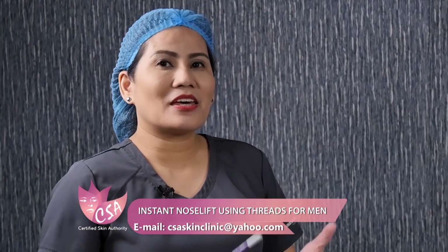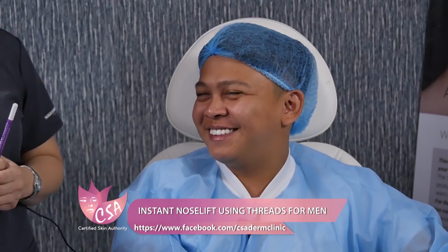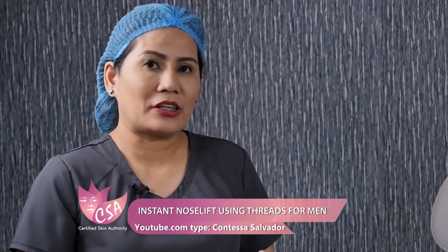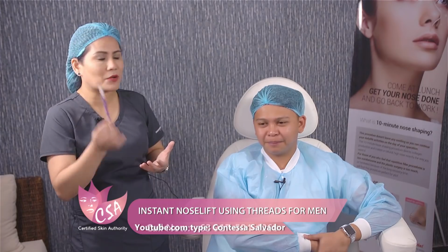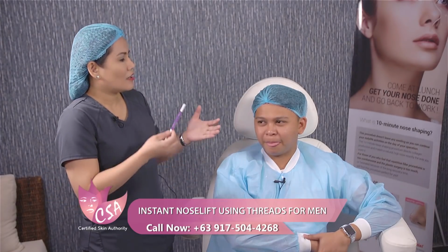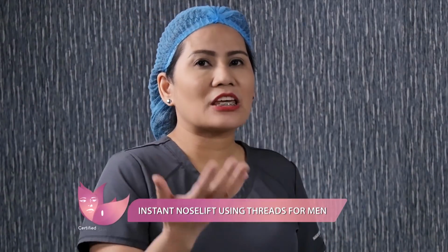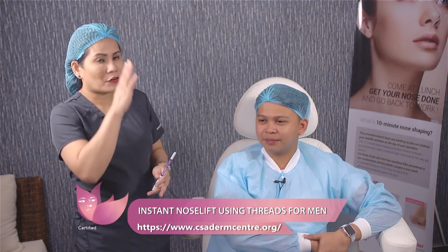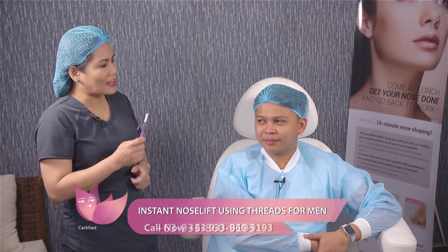So ngayon, ano ba yung magiging treatment natin kay Neil? Excited ka ba, Neil, to know? So much. Yeah. Before we were talking about the nose filler, we did nose filling for Neil. Right now, it's also filling in the nose bridge, the tip columella, but we'll use a product na I should say, kung baga, tumatagal din, and at the same time, it further gives a better shape, much defined shape for the bridge, for the tip. So, let's check ano ba yung ating next na procedure.